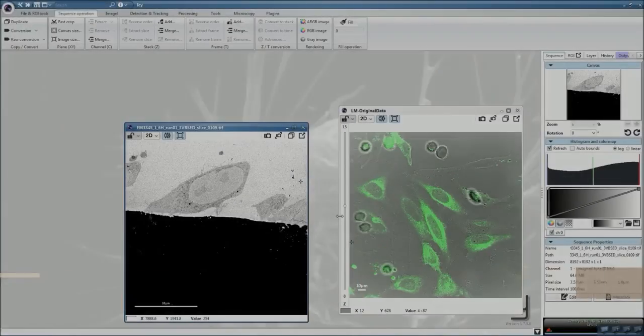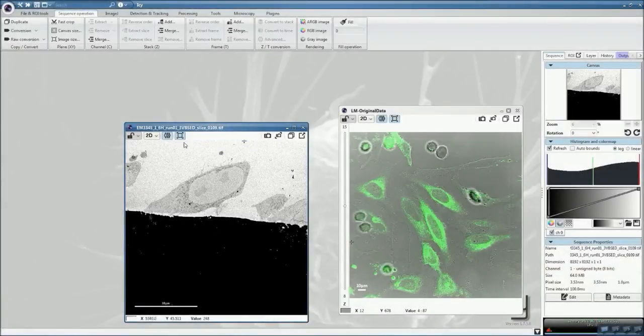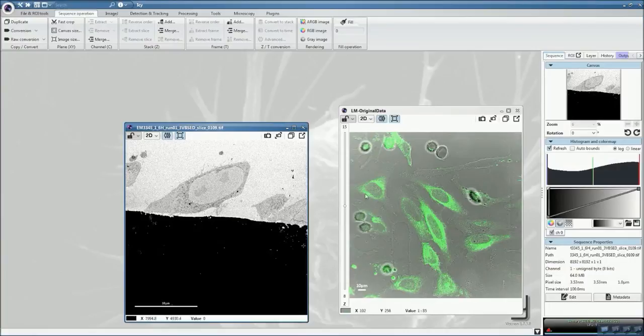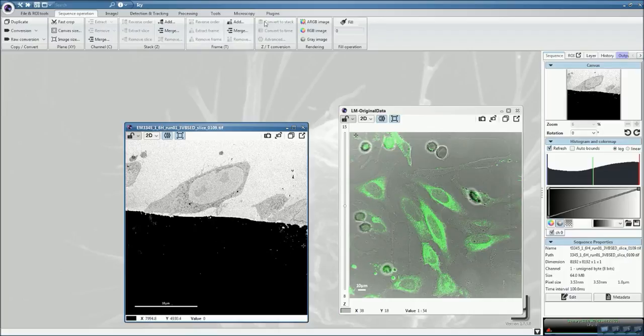In this tutorial, we are going to look at how to register a 2D electron micrograph into a 3D fluorescent stack. This is particularly useful when you want to know how deep you are in your sectioning process.